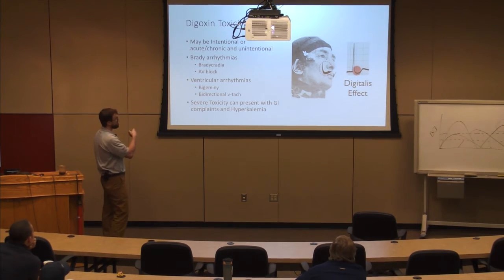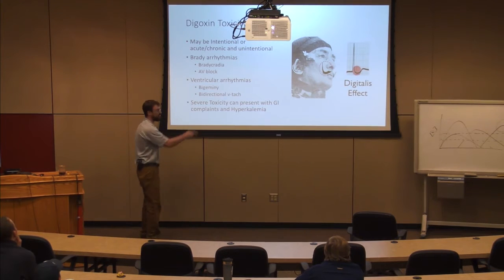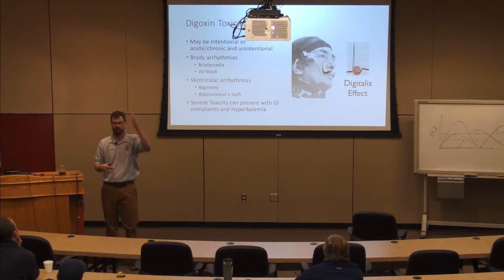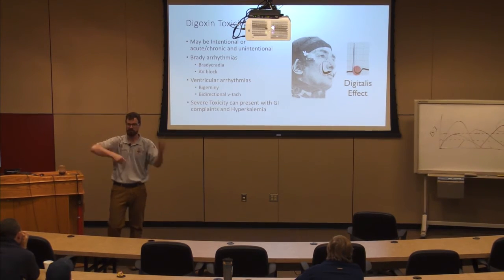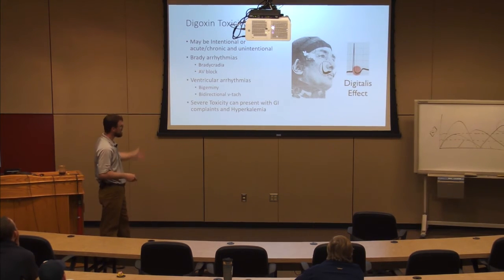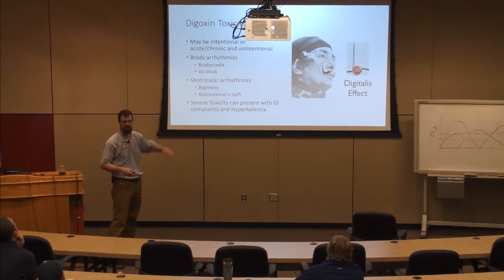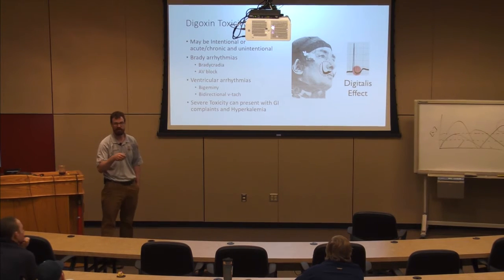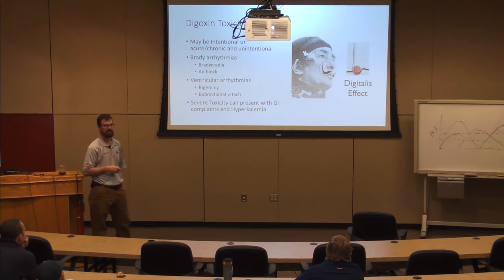So you'll get blocks, you'll get slow rhythms, you'll get fast rhythms, you'll get bidirectional VTAC, meaning you'll get VTAC with a positive deflection followed by a negative deflection followed by a positive, so you kind of get the zipper effect, right? Bidirectional VTAC. You can get anything. It'll mimic hyperkalemia. It's bizarre, okay? When it's not toxic, you'll sometimes see the Salvador Dali effect, right? You'll see this Salvador Dali, that scooping ST, that dishing out of the ST segment. That's a sign of digoxin. It's called the dig effect.